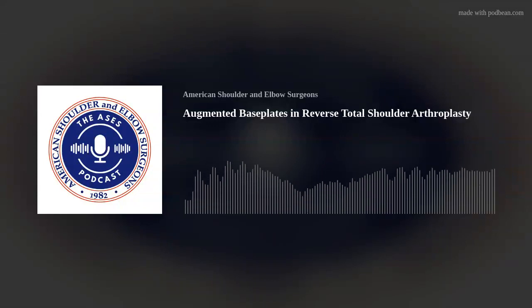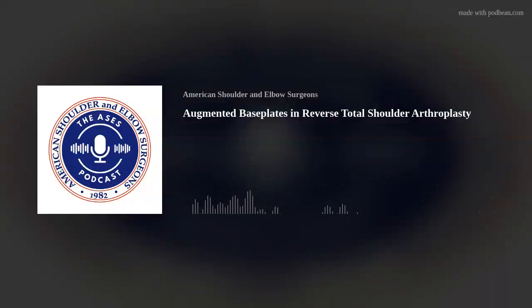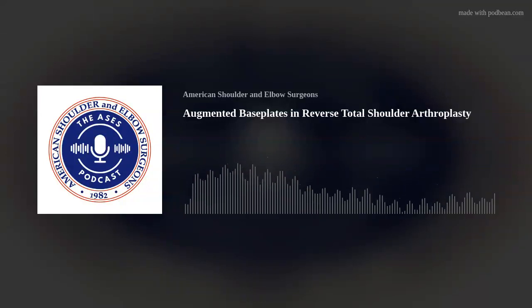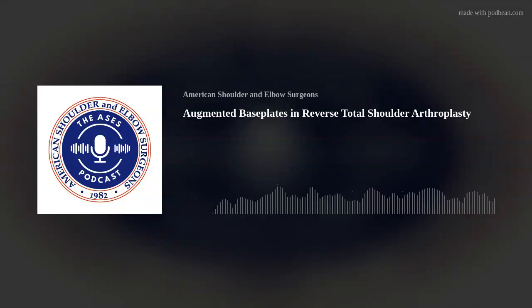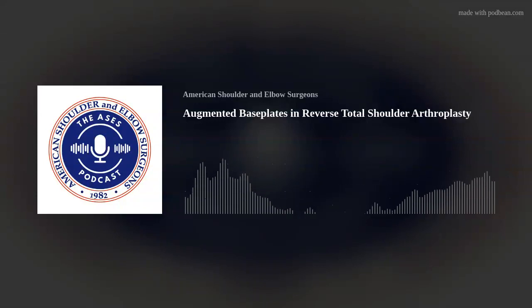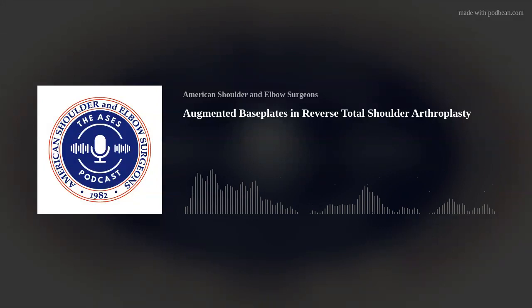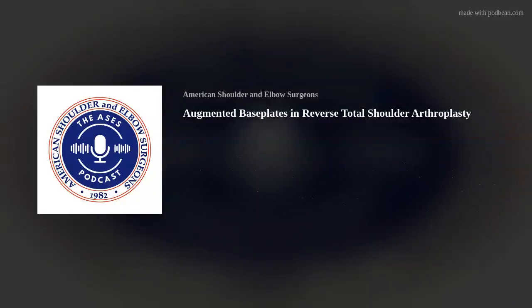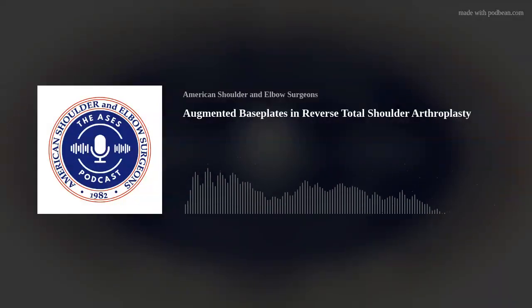I will admit I don't use a lot of custom base plates. I find that for me, off the shelf base plates have worked really well. I think the alternate center line has worked well, or allograft for contained or uncontained defects. I've used either autograft or two-stage with allograft. So I find this scenario works relatively well with off the shelf for me.